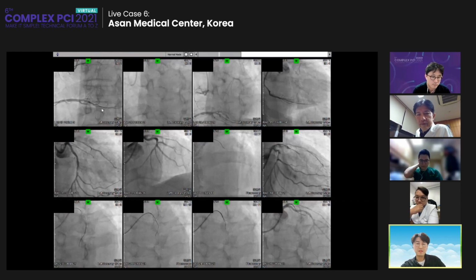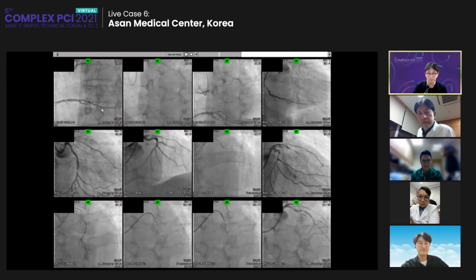But sometimes it is not feasible, as mentioned by Dr. Chan in Hong Kong. So in very selected cases, CT angiography is really helpful, but for some portion of CTO PCI, I think it does not necessitate CT angiography. It is not easy to differentiate which situation is necessary and which is not. That's my big concern. Yeah, I think it depends on experience.